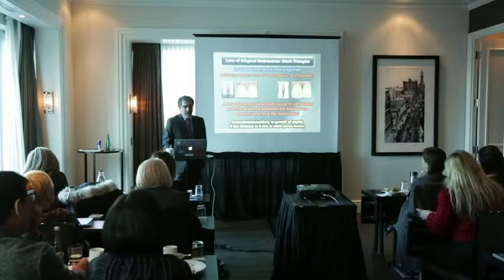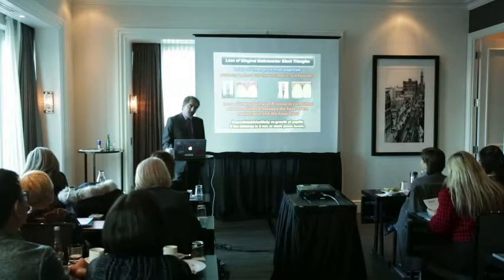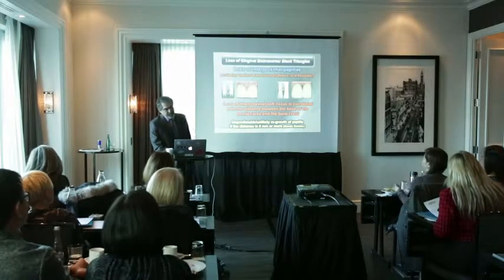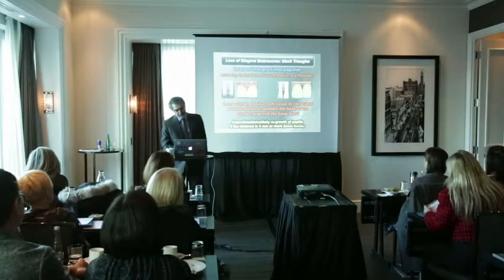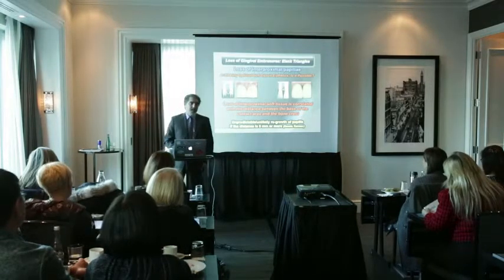Usually, in these cases, if the patient has a high smile line, it will be very difficult, sometimes disastrous. And in most cases, based on Dennis Tarnow's study, probably you have heard that, which is not a very scientific study, but it's practical.